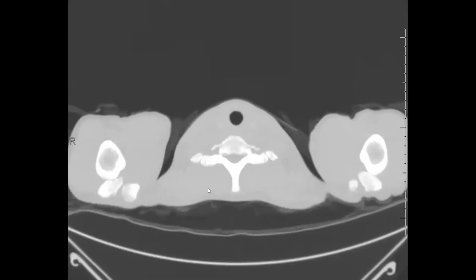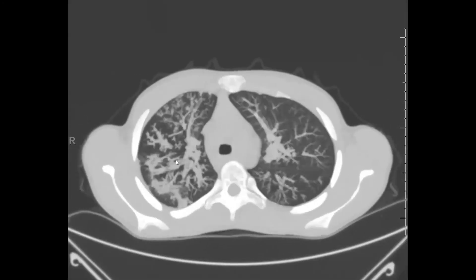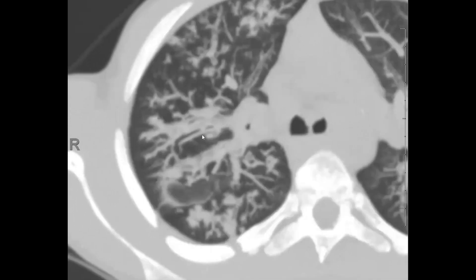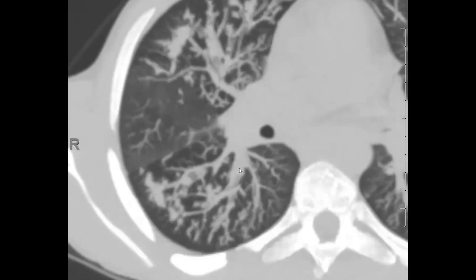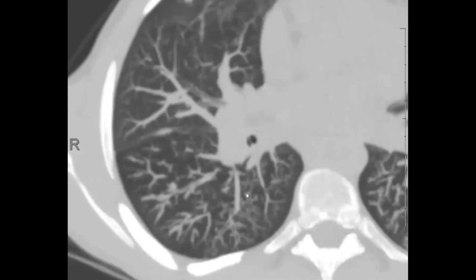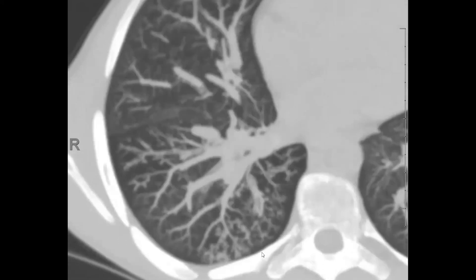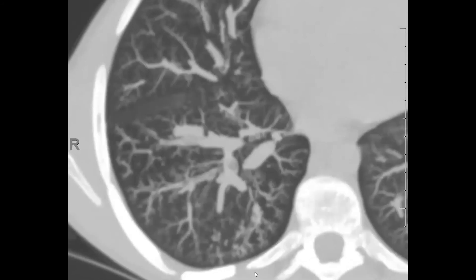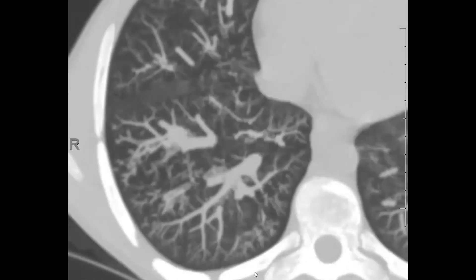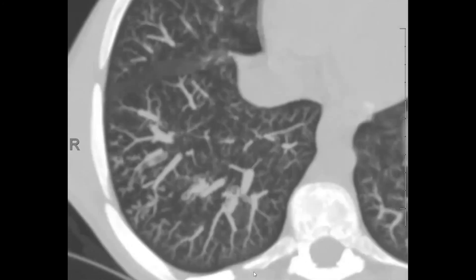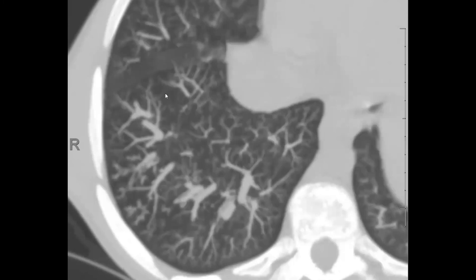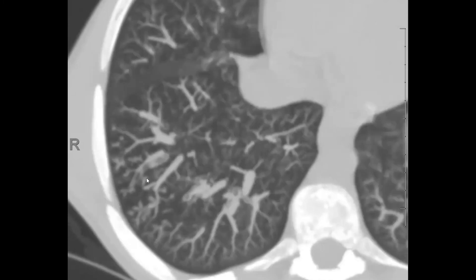Let's pull up the MIPs here, which bring out the nodularity. There's some nice mucus plugging within some of these airways. The tree-and-bud nodularity is much more conspicuous — even the finest tree-and-bud nodularity in the right lower lobe really slaps you in the face. One reason it may be more conspicuous is that it's larger, but also you have some areas of normal lung, which act as your baseline. That internal frame of reference makes your eyes much better at detecting the areas of tree-and-bud nodularity.